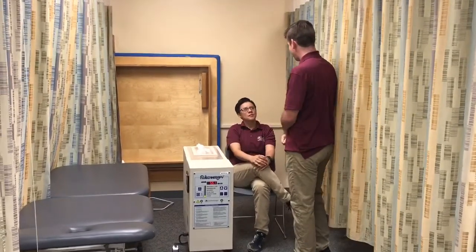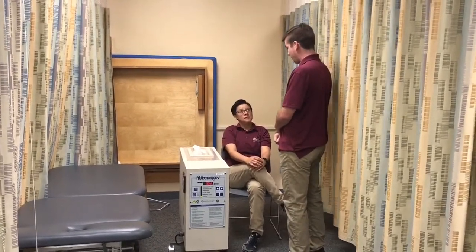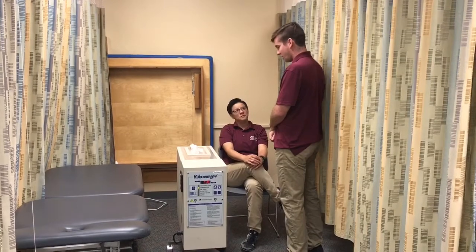Good afternoon Julie, my name is Quinton. I'm going to be your physical therapy assistant student. How are you doing? I'm good, thank you.